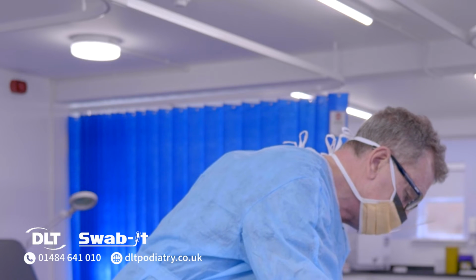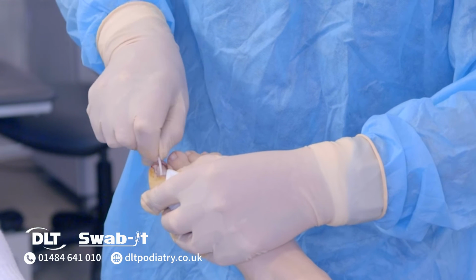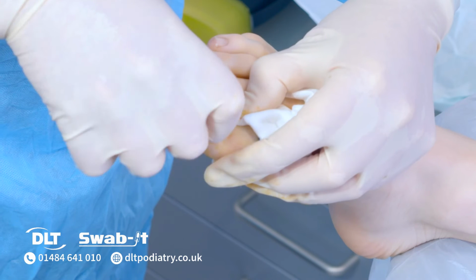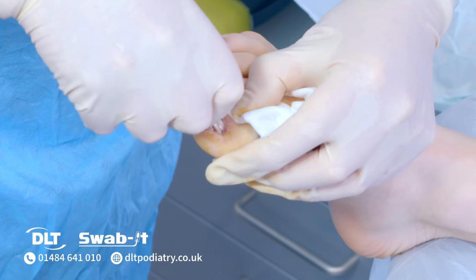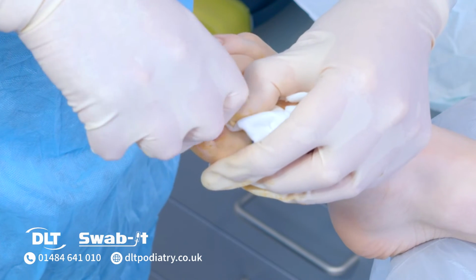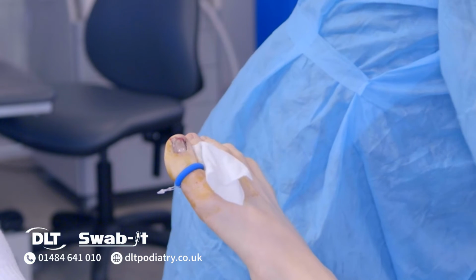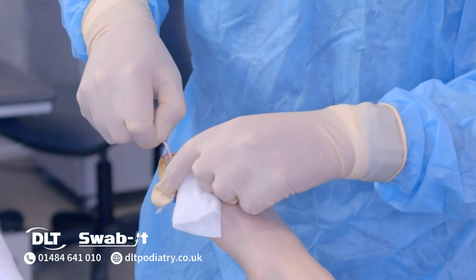And you can hear it break the seal. So this is the last minute. Just stop the timing for a minute. I'll just see if I can get a bit more phenol on there. Just want to really give this the best chance of being successful.